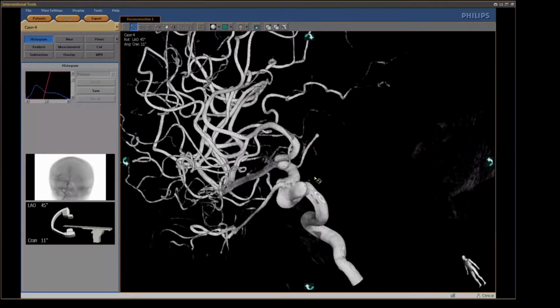We took Fubuki 7 French. The anatomy of the aorta in this patient was okay, but Fubuki is quite a soft guide catheter, and there is not so much support. Okay, let's change this.